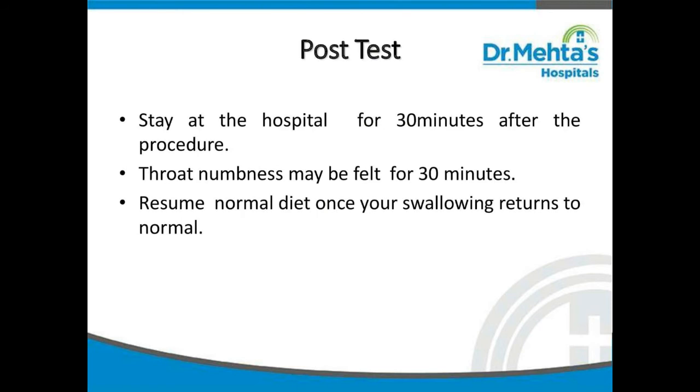Following the procedure, the patient is advised to stay in the hospital for around 30 minutes. Throat numbness may be felt for around 30 minutes, and the patient is advised to take a normal diet once swallowing returns to normal.